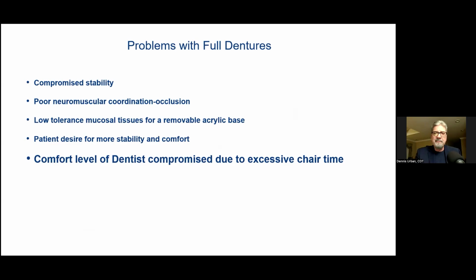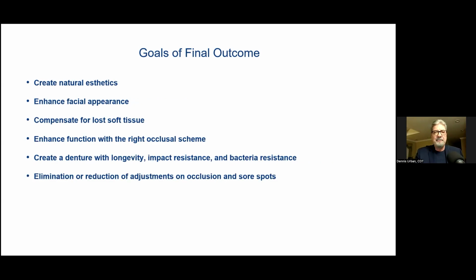So some of the problems with full dentures are compromised stability and poor neuromuscular coordination. We talk about occlusion, low tolerance for mucosal tissue with sore spots, especially on a lower denture, and the patient's desire for more stability and comfort. And as I mentioned earlier, the comfort level of the dentist is compromised due to excessive chair time. I speak to a lot of doctors, and a lot of doctors say, I just don't like doing dentures. It takes too long, too many adjustments. But it doesn't have to be like that. There's more predictability now with the process of making a denture.